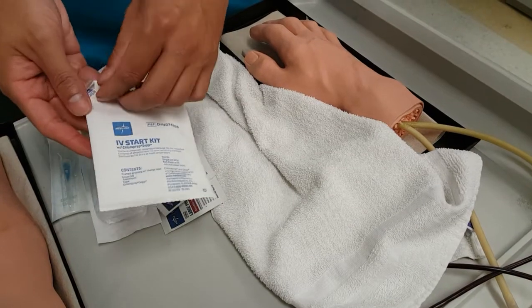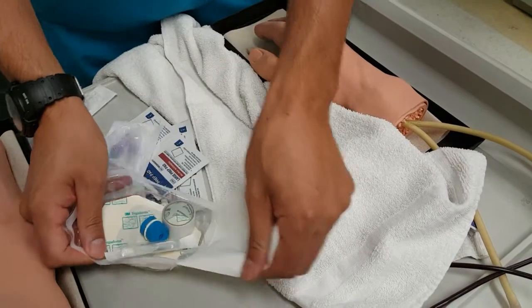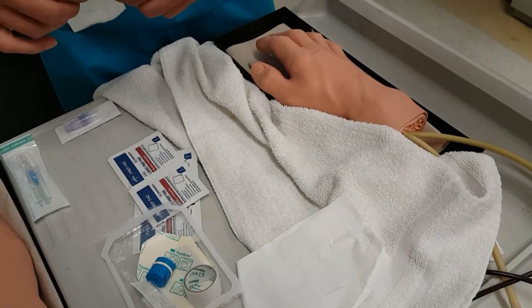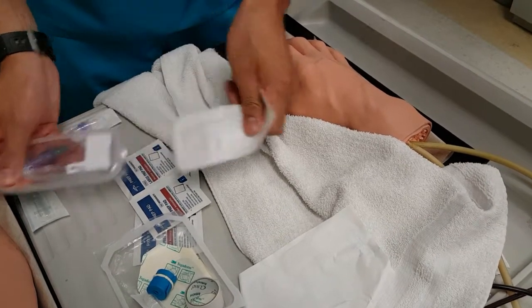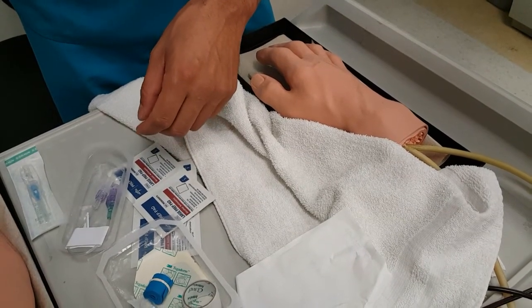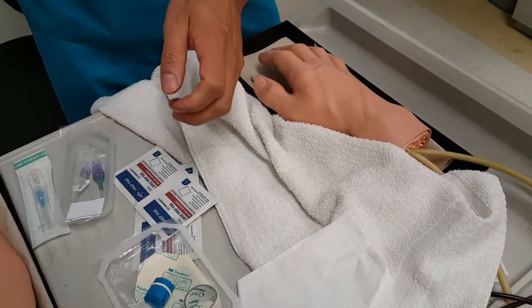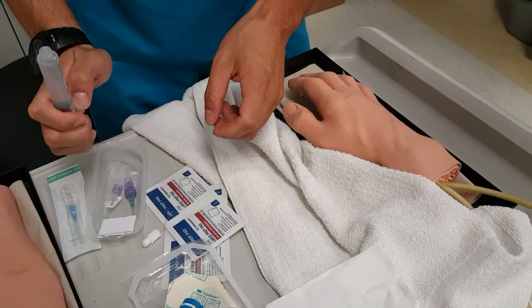Open up all your materials so you have them prepared. I need to flush this so I'm not injecting any air into the patient, so let me prime that.